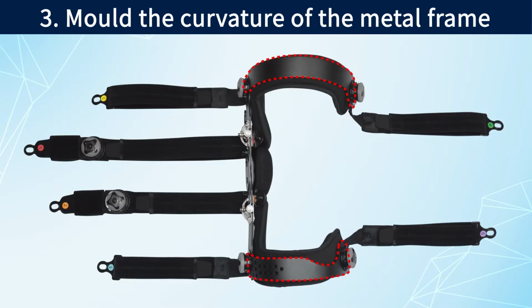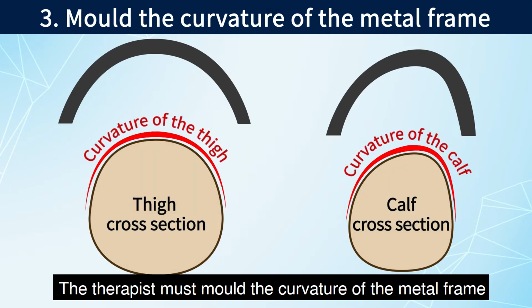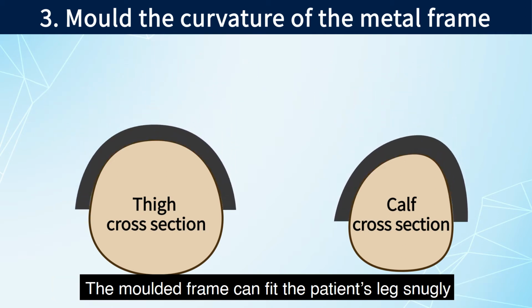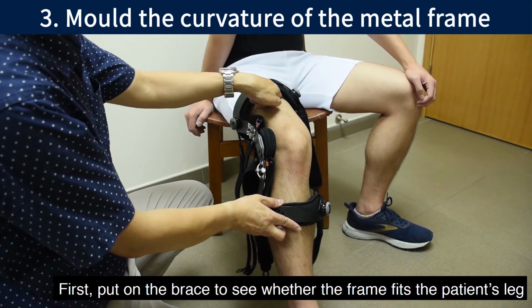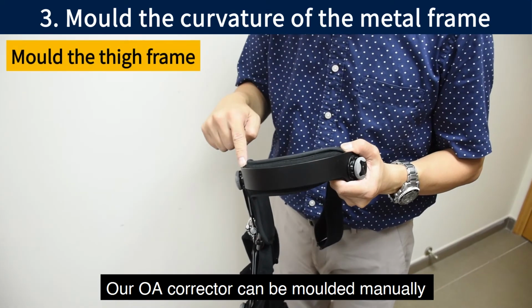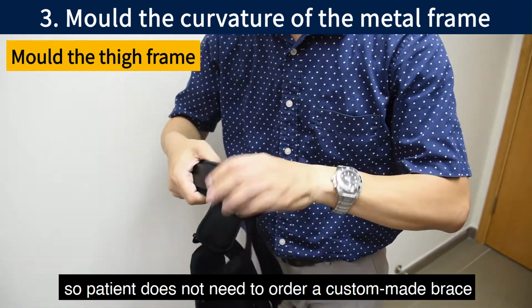3. Mold the curvature of the metal frame. During initial fitting, the therapist must mold the curvature of the metal frame according to the curvature of the thigh and the calf of the patient. The molded frame can fit the patient's leg snugly. First, put on the brace to see whether the frame fits the patient's leg. For example, the following photos show an unmolded frame. Our OA corrector can be molded manually, so patient does not need to order a custom-made brace.